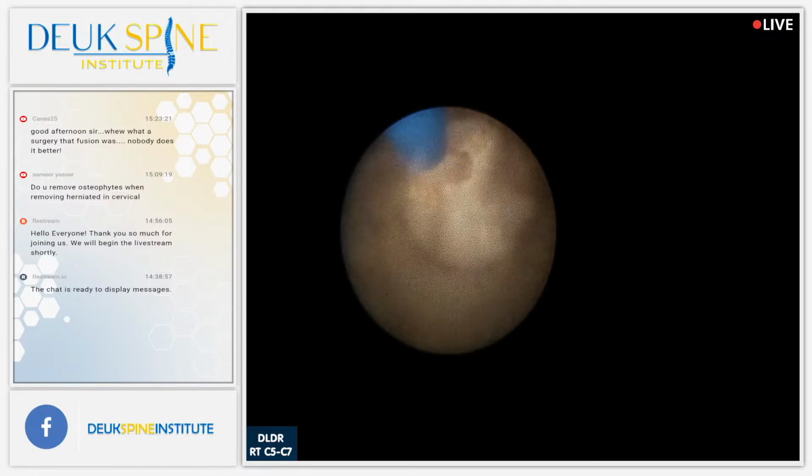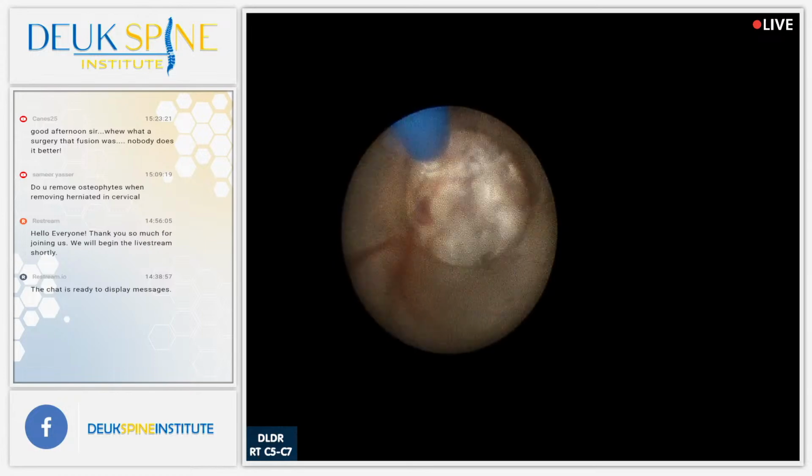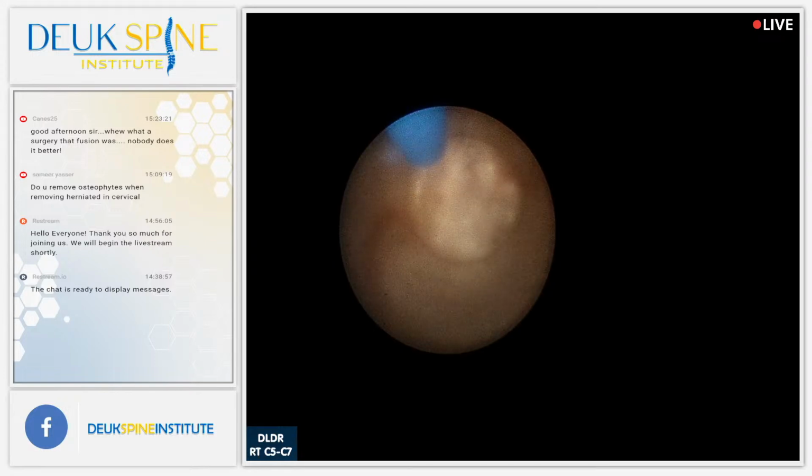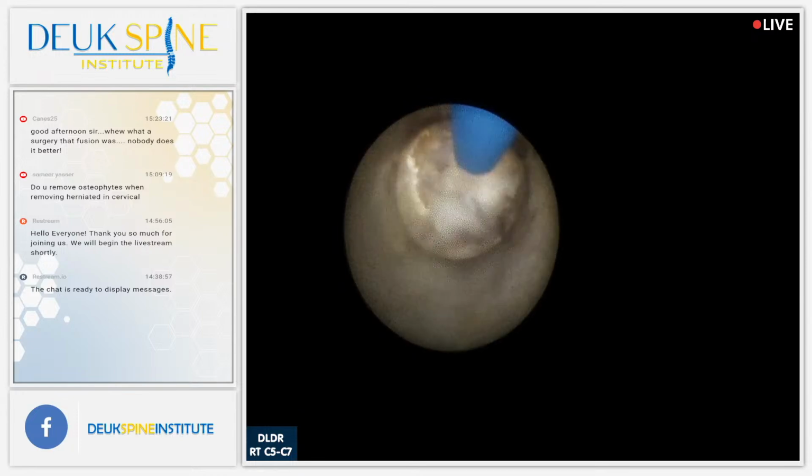Yeah, is he still relaxed? Hey, what do you need, sir? I just need the shoulder. I'm trying to get the clavicle to go down a little bit. There's a big herniation right there. See that?